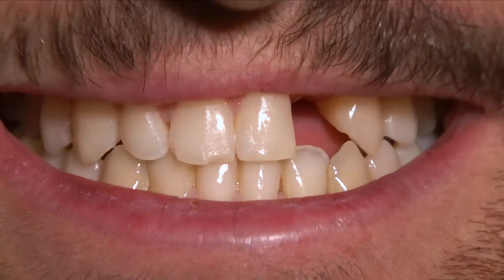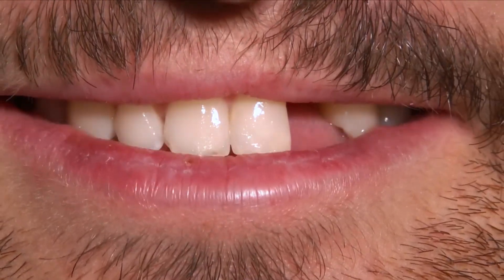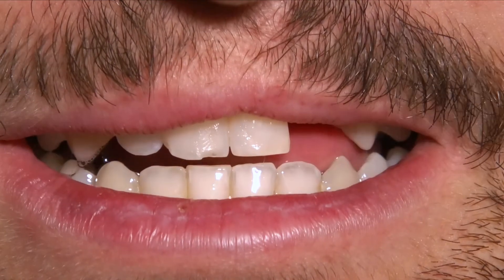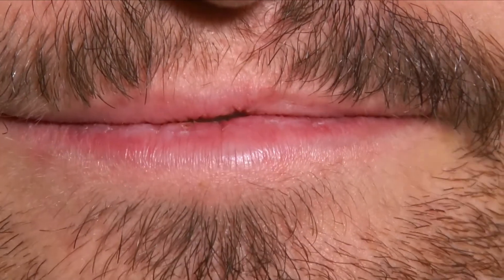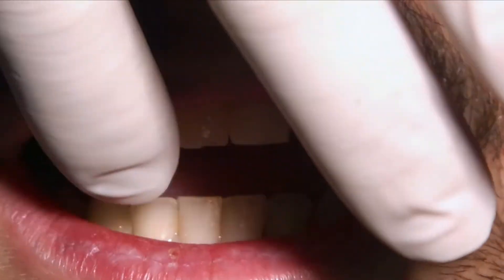So this is the patient — she's a lady, as you can see, and there is a missing tooth at the level of the lateral incisor. Now we can show you the intraoral situation.